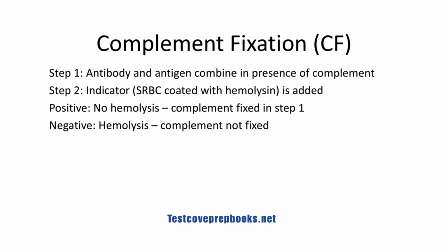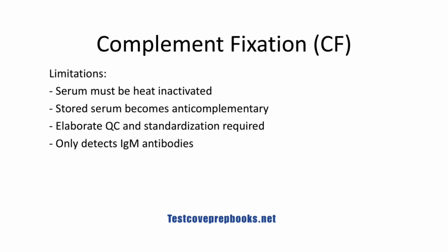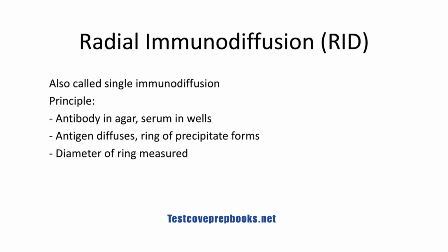On the other hand, if complement was not fixed, it reacts with the indicator, causing hemolysis, which represents a negative test. Complement fixation has some limitations. The serum must be heat inactivated, stored serum often becomes anti-complementary, strict quality control is needed, and it primarily detects IgM antibodies.